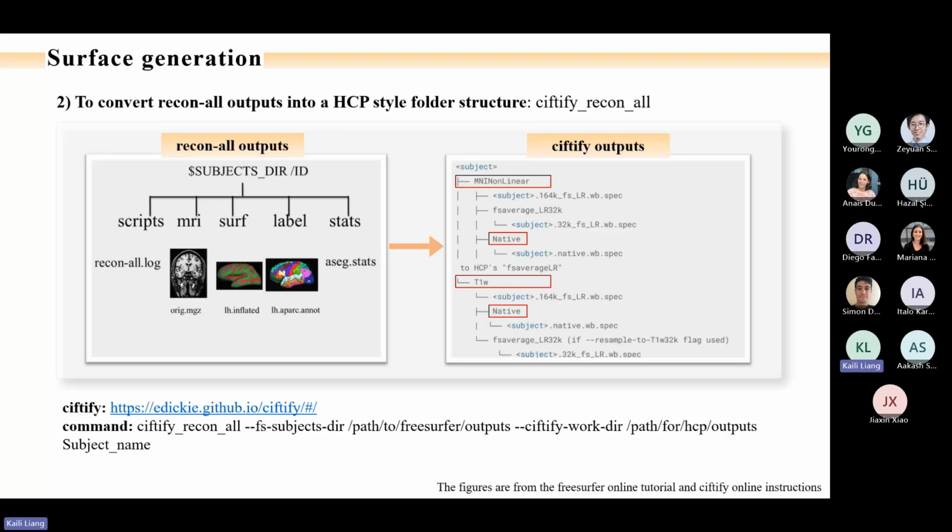Another thing is, I think you should know the NIFTI file is for volume data, and the GIFTI file is specifically designed to store surface data, and the CIFTI file is for combined volume and surface data. This is very basic. But only the volume from the deep gray matter. Sorry? It's only the volume corresponding to the deep gray matter. Only gray matter. Yeah, in CIFTI.